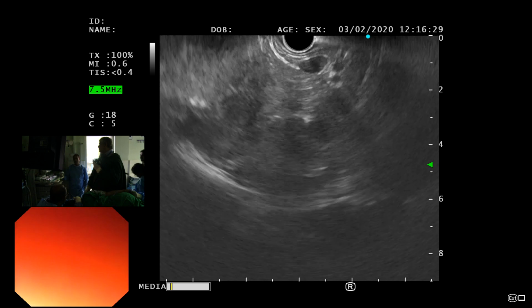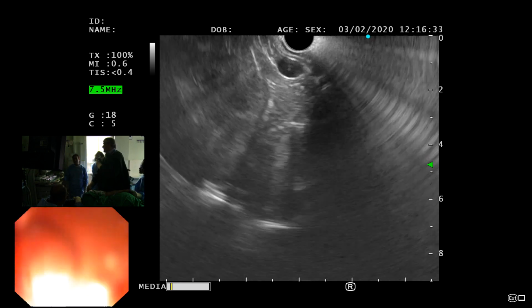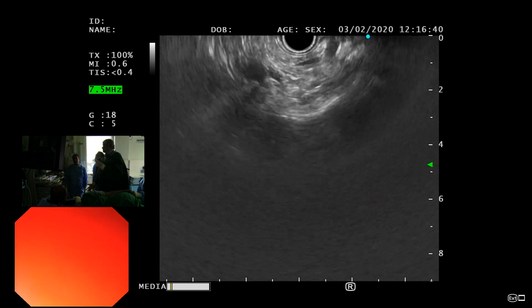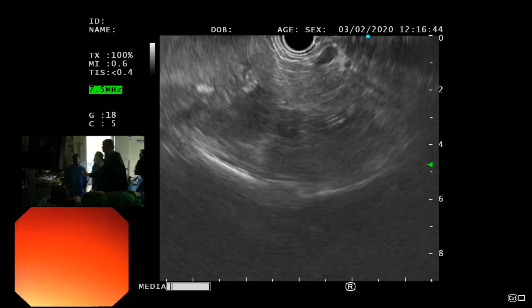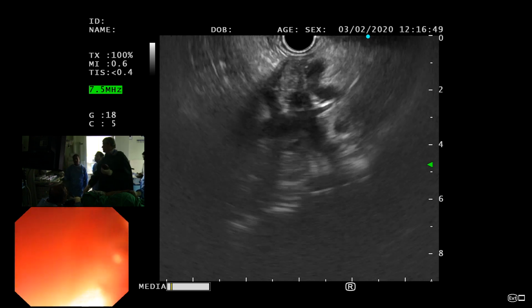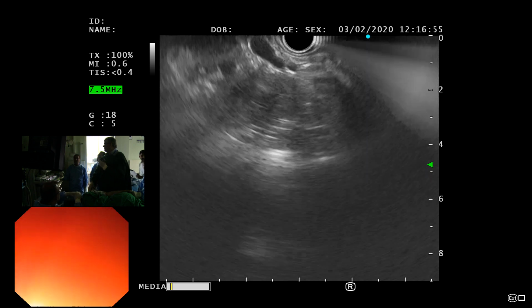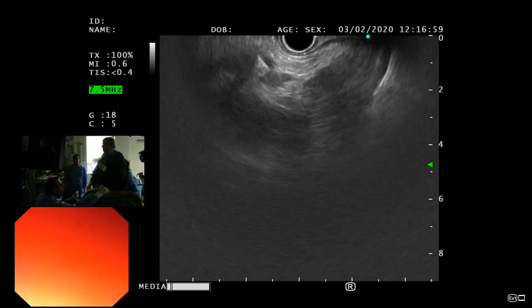I haven't seen that. So you've got spleen, kidney, and again, just as Khalid was telling you, you don't really have to do much to go one way from spleen to the other way, which is all the way to the neck. Okay. Yeah, I think you're right. It's like the body and tail, distal body and tail, they are completely atrophied. Yeah. So that goes against that.